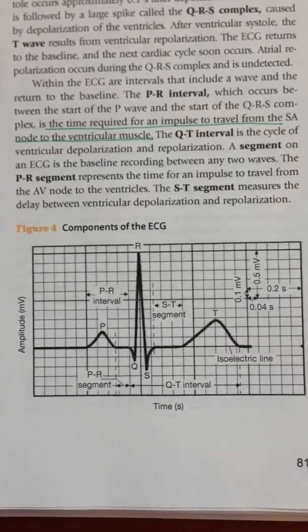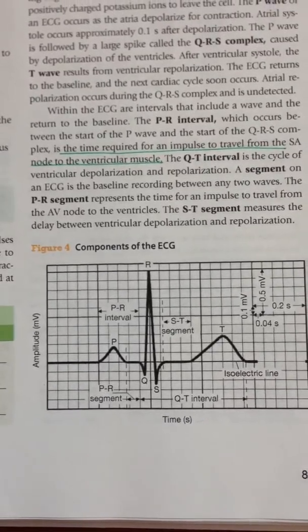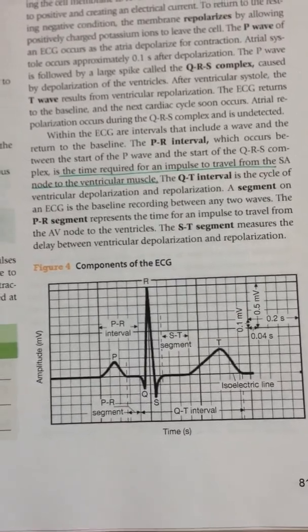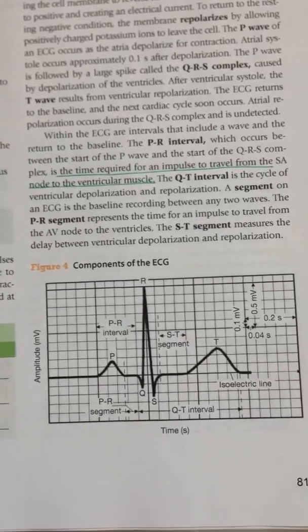This is an EKG. The EKG, known as ECG as well, is electrical events in the heart that are detected by electrodes on the surface of the body and recorded. There is depolarization and repolarization.